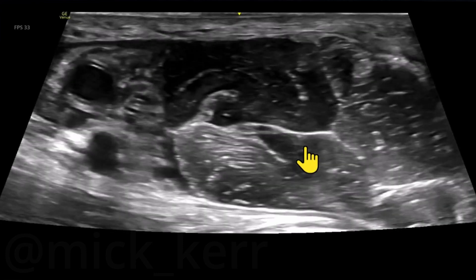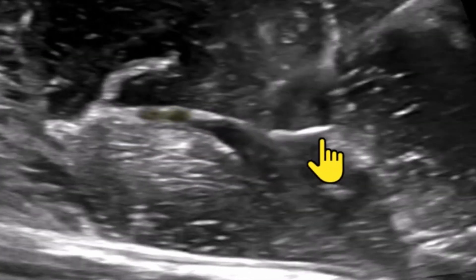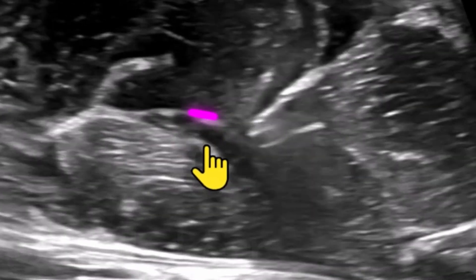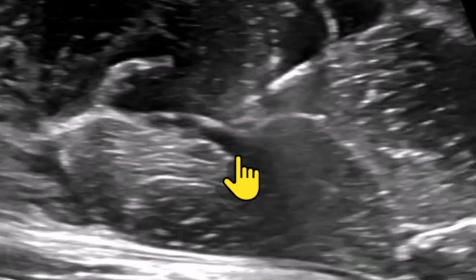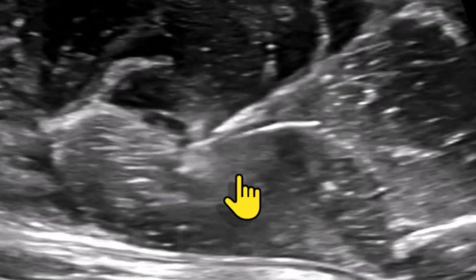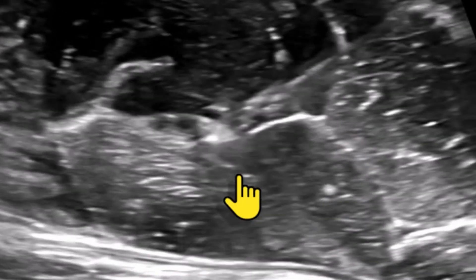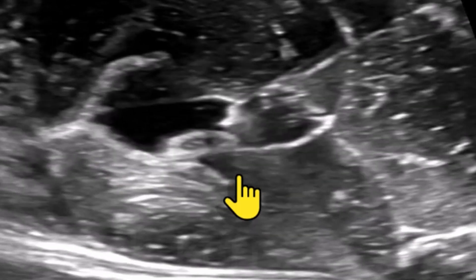Coming back now, not going out of the skin. The musculocutaneous nerve is here — there's a nice interfascial plane that I'm going to target. Popping down, a little injection there. Not happy with that, going a tiny bit further. Tiny little release there, and a pretty good spread. Quite happy with that.